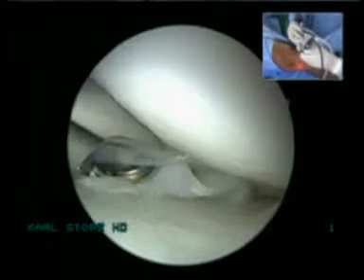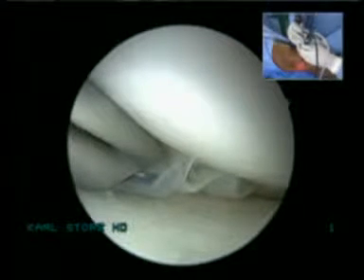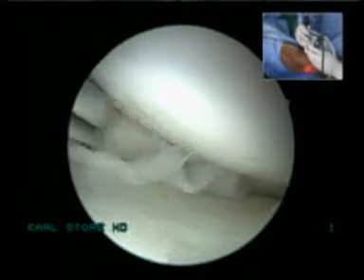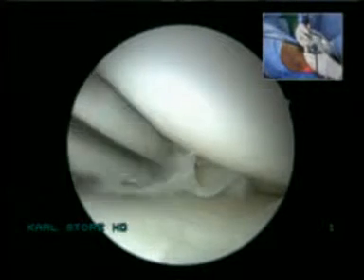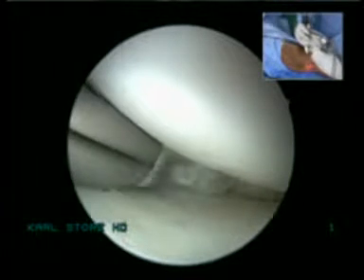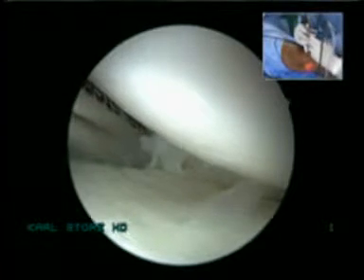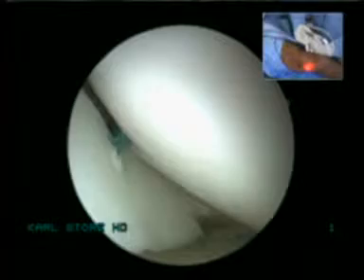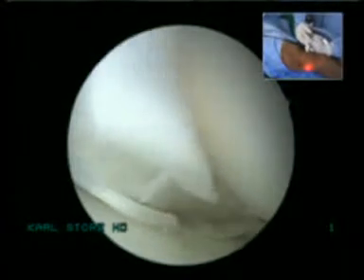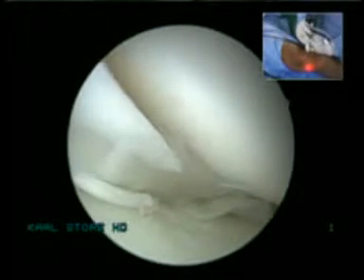Okay. Can you turn the shaver on? Shaver, I need the shaver. Okay, another one of this outside-in things? Yes, sir. The cannula and suture material.